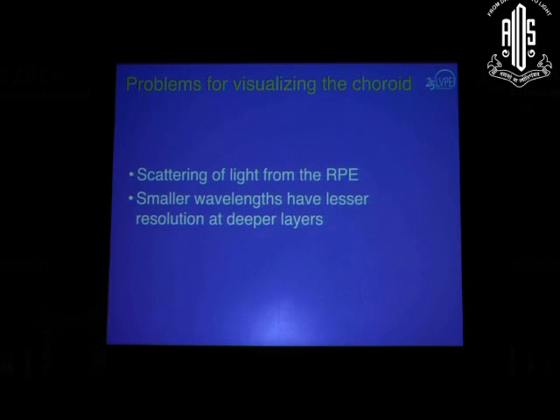I'm going to touch only on spectral domain OCT. I'm not going to get into swept source OCT or adaptive optics OCTs, which can image the choroid a little better than spectral domain OCT at this point, though they are not in regular commercial use that often. What we have in clinics is only spectral domain OCT.